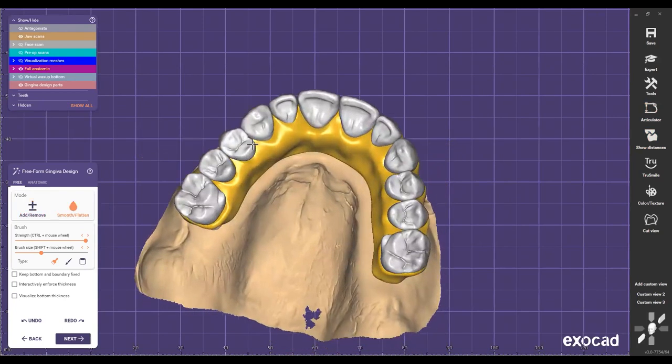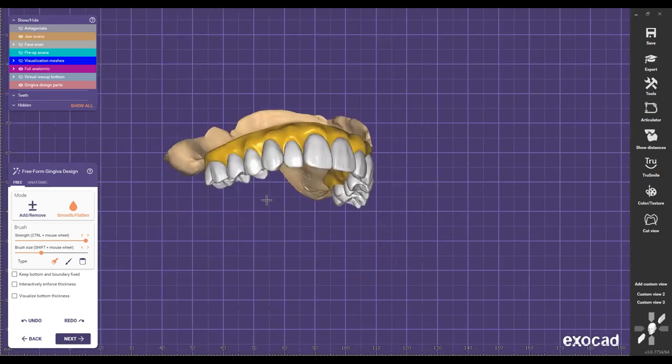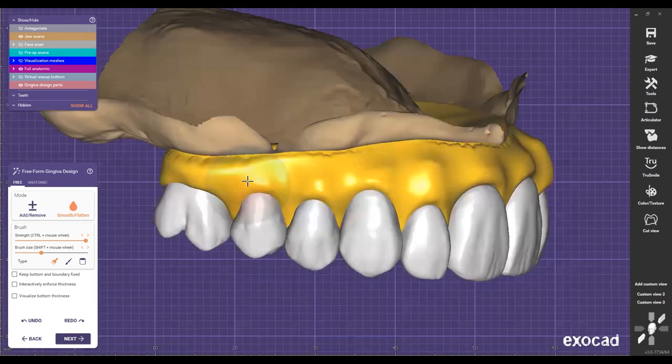Once you start seeing those videos, it just makes sense what you're doing here. It makes everything so much easier, much more fun, right? Because you think, oh, okay, I know where this technique is coming from. And once you see that, it's like, oh, okay, I thought I was not doing it right? But when you see those videos from analog, wax and all that, this makes much more sense to you. So it makes it easier to understand this technique.